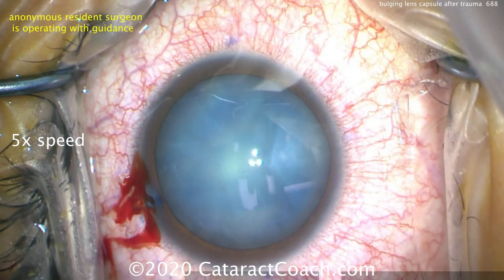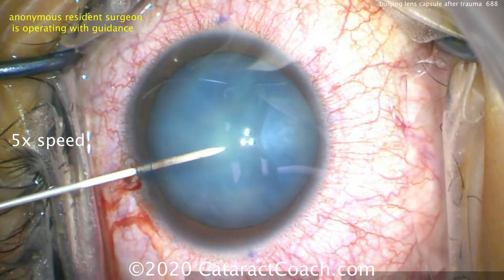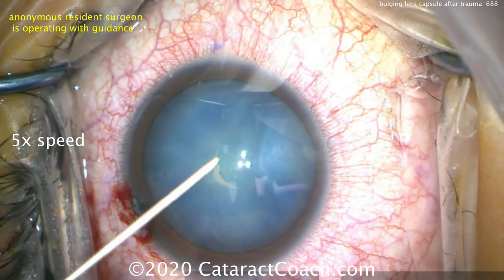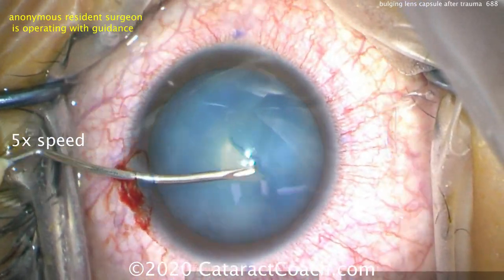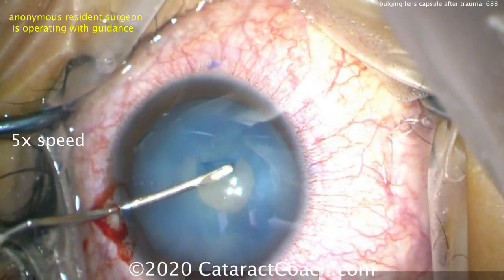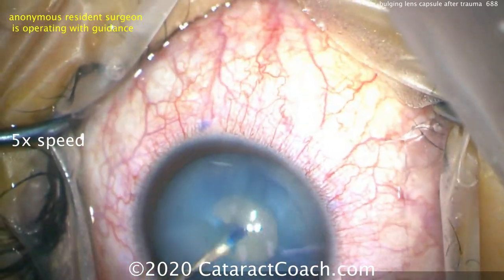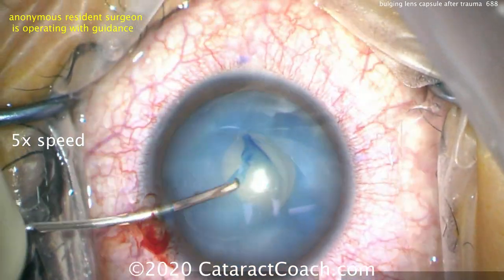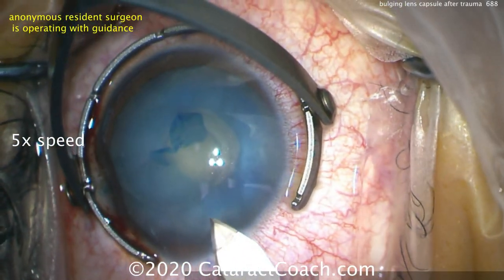Here's the patient's second eye being done by a different resident. Again, poking in with the needle, aspirating out lens material, and now we're going to use the cystotome and do a double rhexis technique. Using the cystotome to create a very small central capsulotomy — this is going to be the first baby capsulorhexis. We can remove the lens material, and afterwards we can enlarge the capsulorhexis. There's the small baby capsulorhexis, and here's the phaco incision.